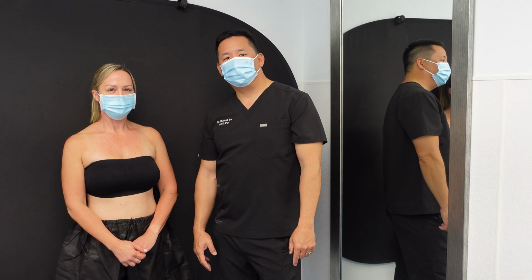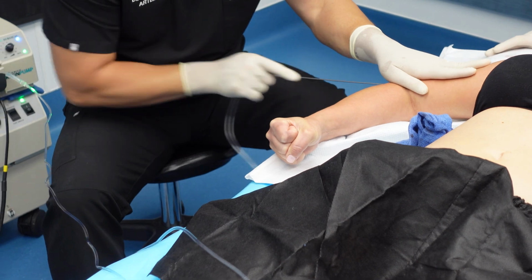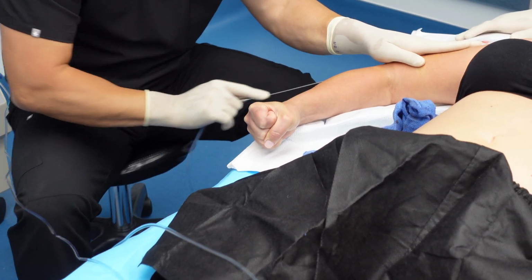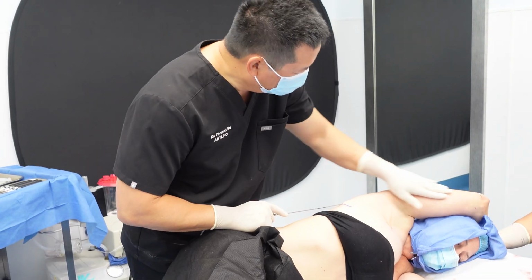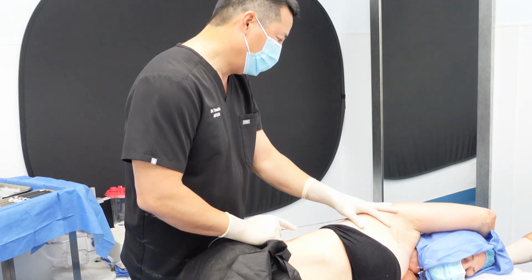To be doing a celebrity arms case today. And I'm in a fairly thin layer, and I want to make sure that I'm traveling that layer very smoothly. This little area is all that other doctors do, right here, this lower edge of the arm.